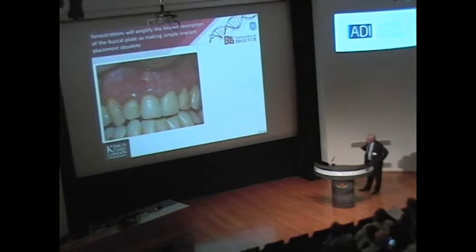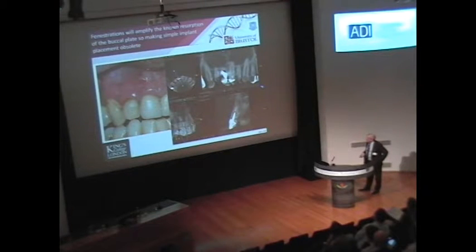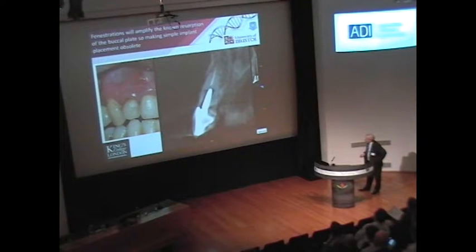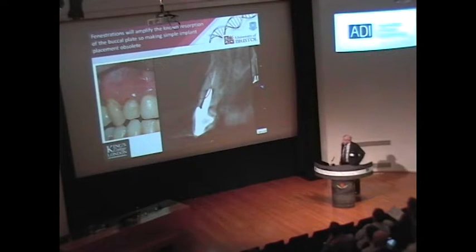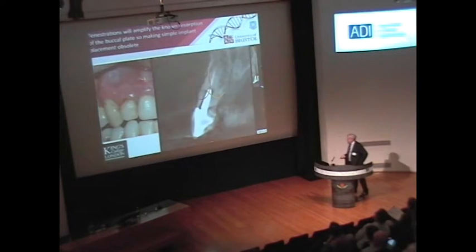So, we have amplified problems. And today, because we have our cone-beam CT, we can come along and analyse that buccal plate. And the buccal plate here, we can see, has got a fenestration. It's got very minimal bone at the coronal aspect, and you can expect bone resorption to go in this direction. Doesn't matter what you do, it's going to happen.